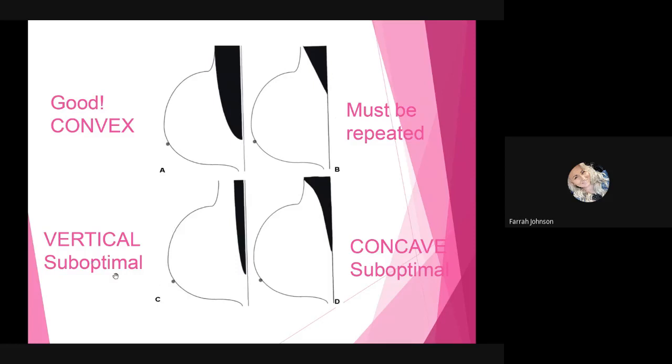Okay, and then also suboptimal, you should see a nice wide pectoral muscle kind of convex down your image. If you see it kind of straight like this, you don't necessarily need to repeat it, but it's suboptimal. And then same thing with image D, this kind of concave appearance. This isn't repeatable as long as you can see it posterior to the nipple line, but of course it would not be optimal.